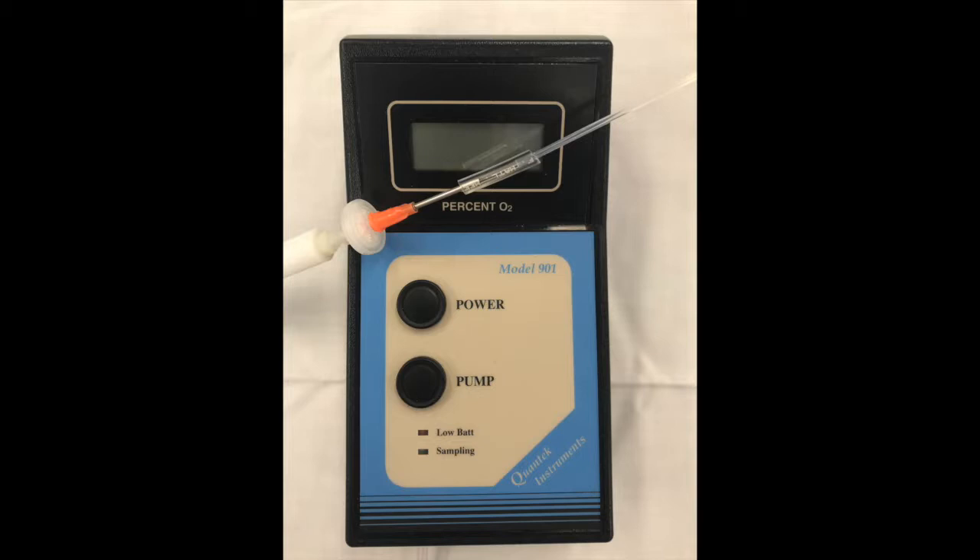This little machine isn't mandatory for boost cross-linking, but I really do like it as a check. It's an oxygen sensor, and it allows us to ensure that the concentration of oxygen in the goggles for the boost procedure is above 95%, which is the optimal level. Having the oxygen sensor has really helped us, as we've learned about the procedure, to iron out the technique and ensure the procedure is as safe as possible for patients.